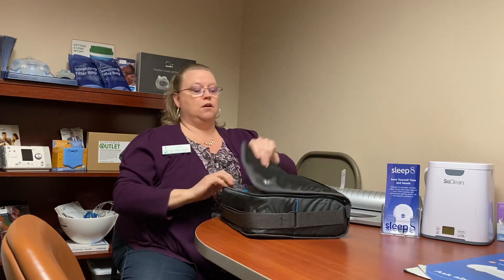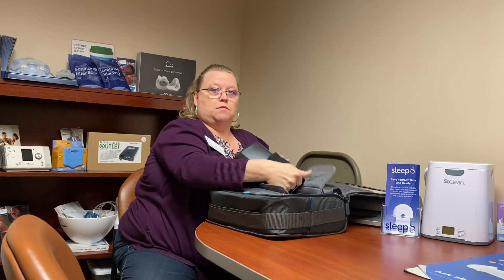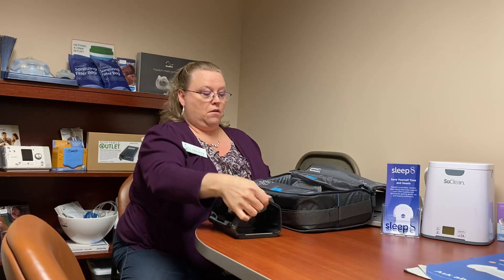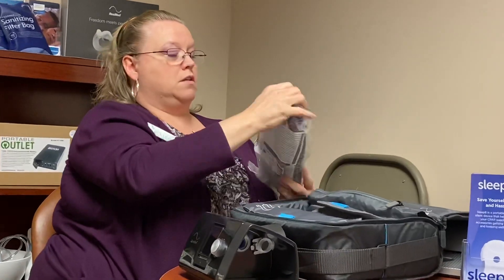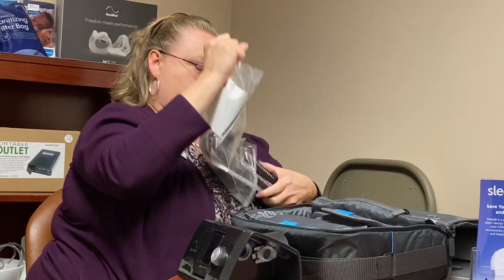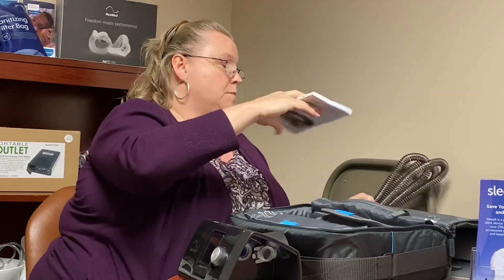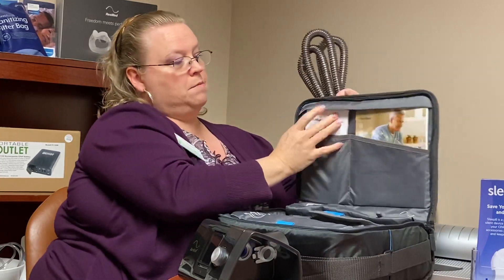So when you get home, I'm gonna go ahead and open up your bag here. You'll see everything's got a compartment for everything. We're gonna first start off with taking the machine out, then we're gonna go ahead and get the tubing out. There is some literature, and there is a spot for everything — go ahead and put that literature in here for safekeeping.